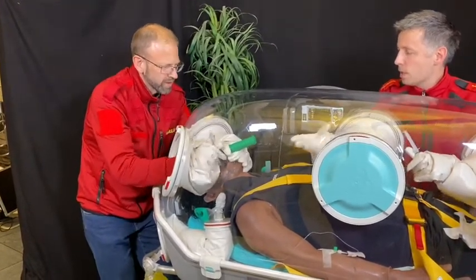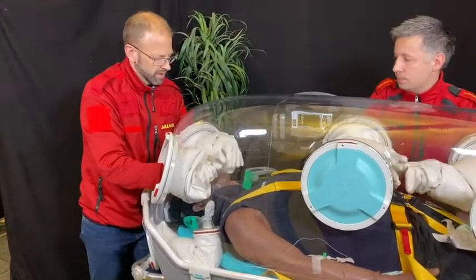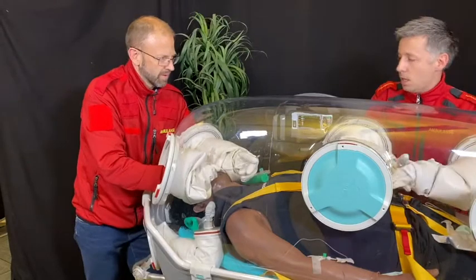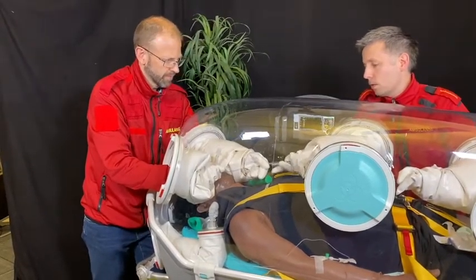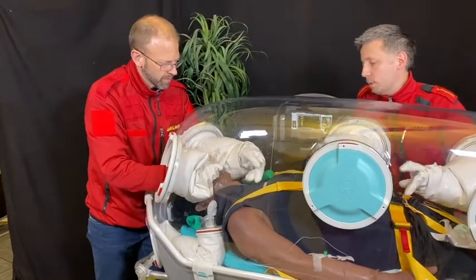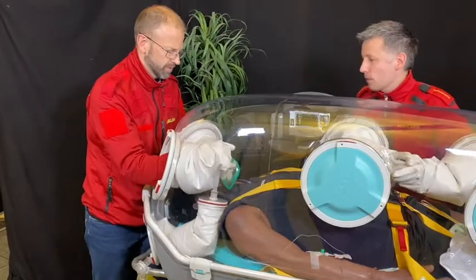There you go. Pulling the stylet — the stylet is out. And you can then do the cuff — that is eight milliliters of air.